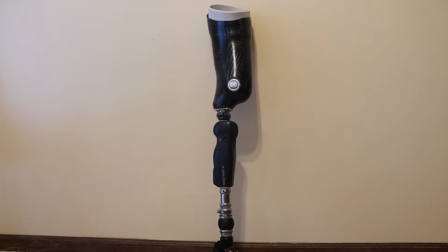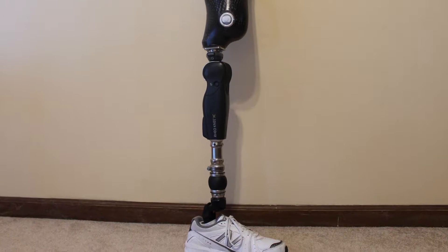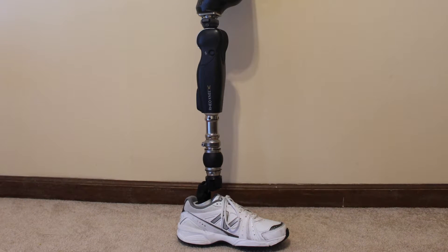This knee also features a hard lock mechanism, activated by a button on the side which I'll show you in a minute. This mechanism allows you, when standing, to lock the leg so you don't have to worry about it giving out on you, and you can relieve some of the weight from your good side.